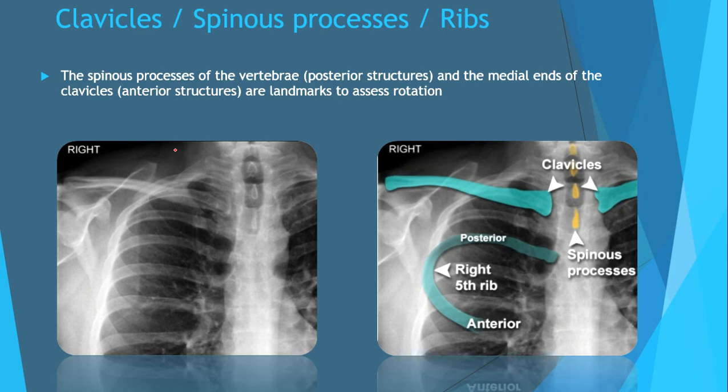We see clavicles on the equal level, so we have no rotation. It's a good anterior-posterior film.